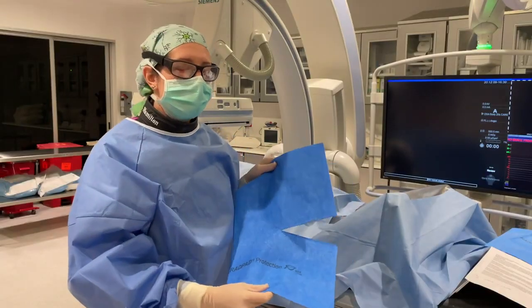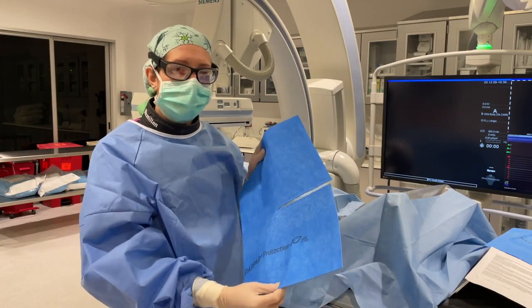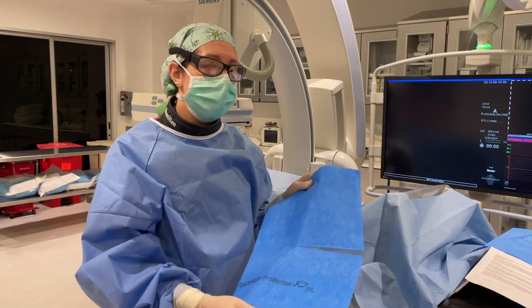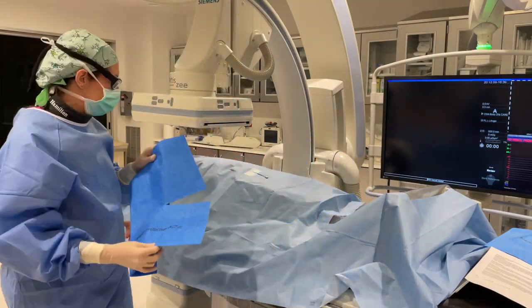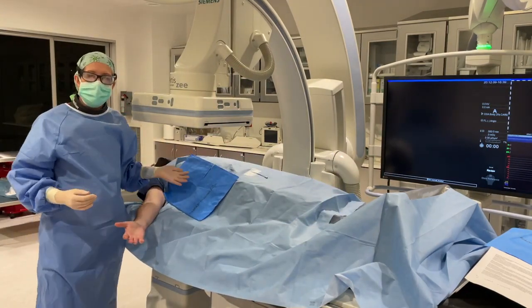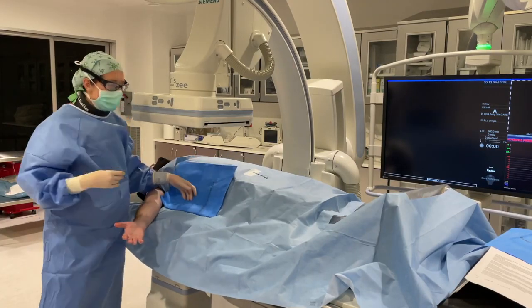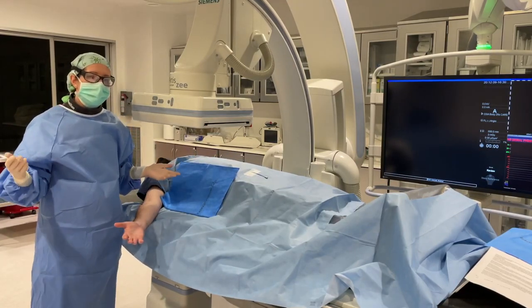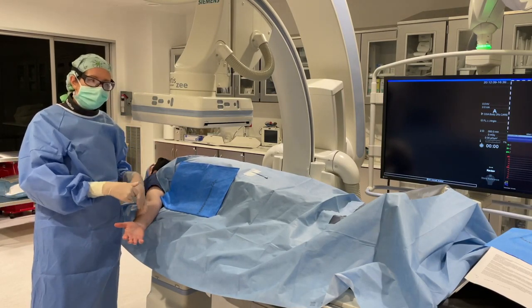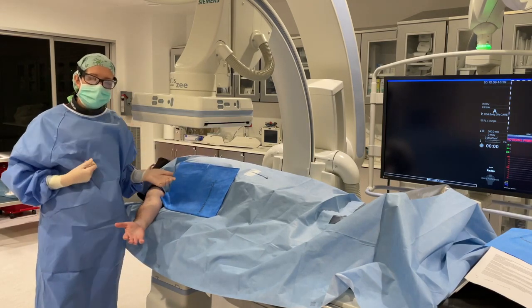For fluoroscopically guided procedures using the upper extremity for access, you can use the RADPAD by placing it between the operator and the area to be imaged. So for example, in a fistulogram, I can place the pad here on the patient's right chest wall to protect myself from scatter when I do the central venogram. And the same placement would hold for a radial artery access case. When I access the radial artery, no matter where I'm imaging in the body, this pad will provide scatter protection to the operator.